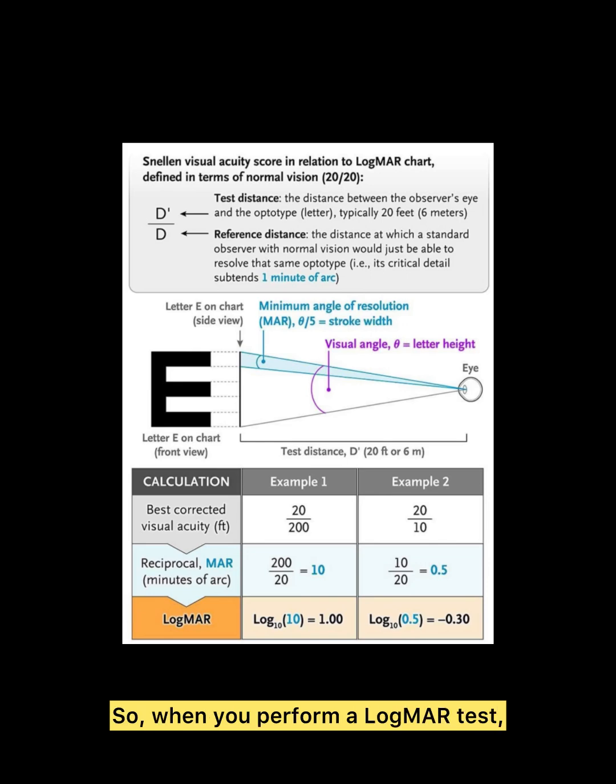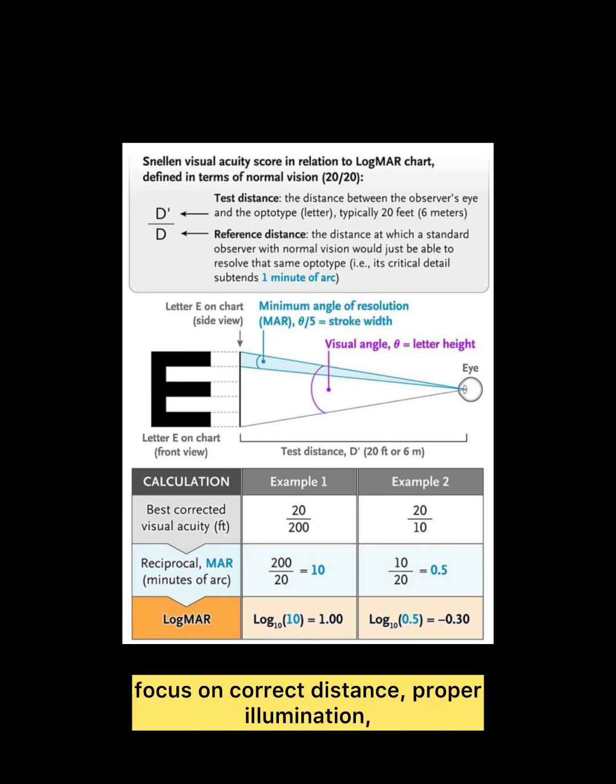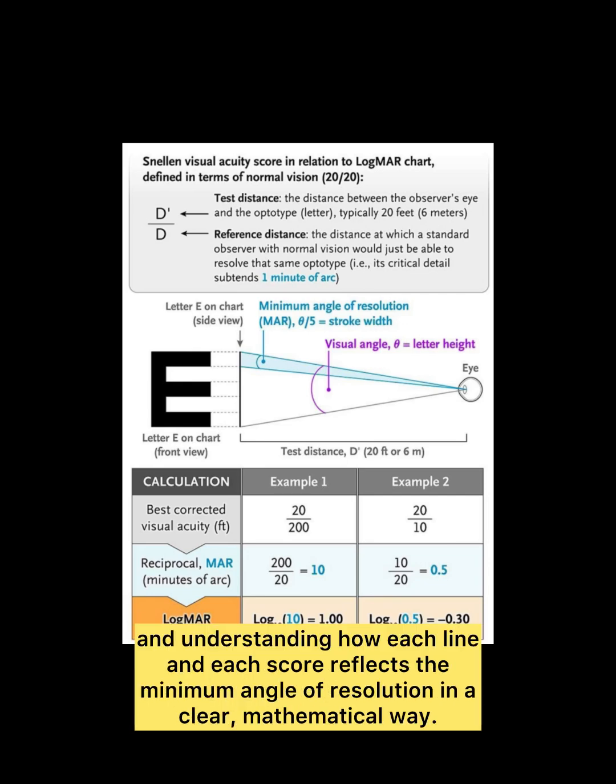So, when you perform a LogMar test, focus on correct distance, proper illumination, encouraging the patient to read every letter, and understanding how each line and each score reflects the minimum angle of resolution in a clear, mathematical way.